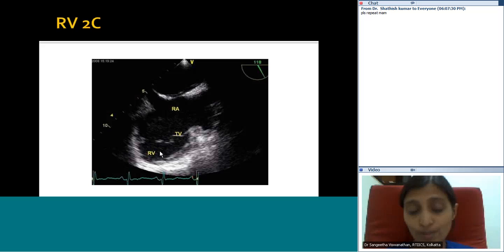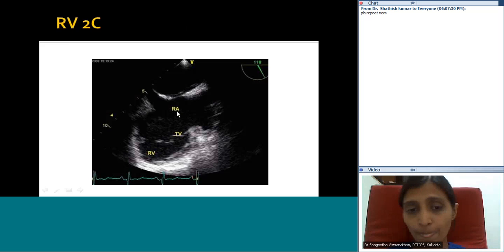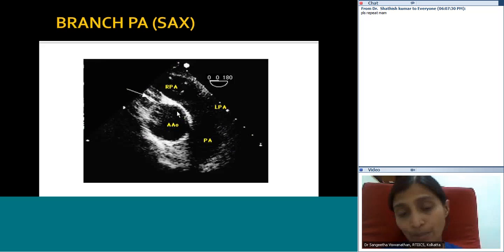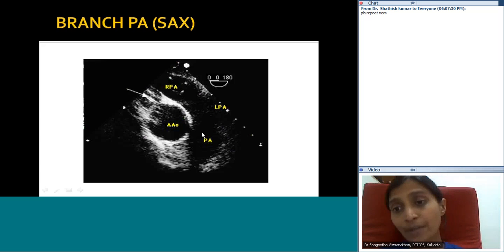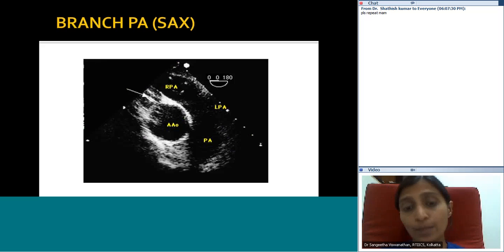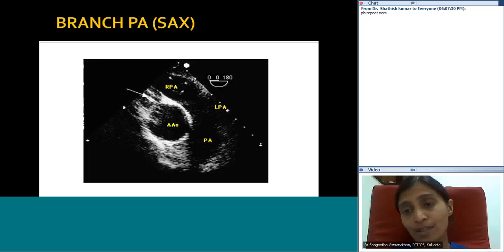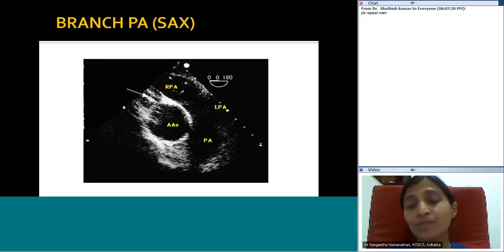For the branch pulmonary arteries, this is done at a slightly upper esophageal level at zero degrees as you withdraw the probe upward. You see the RPA much better than the LPA. So we have now gone through the various portions of the heart: left-sided structures including the LA with pulmonary veins, appendage, mitral valve, LV, aortic valve, and aorta; and right-sided structures including the RA, tricuspid valve, venae cavae, RV, and pulmonary artery.